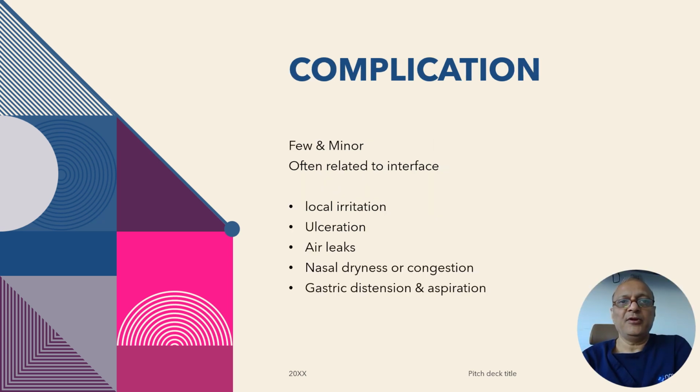Complications of NIV are few and minor, and are mainly due to the interface. They include gastric distension leading to aspiration, nasal dryness, air leak, local irritation or ulceration over the face, particularly the nasal bridge.